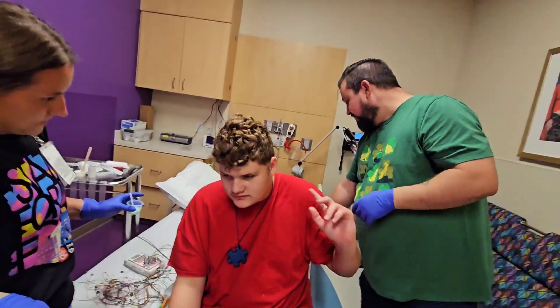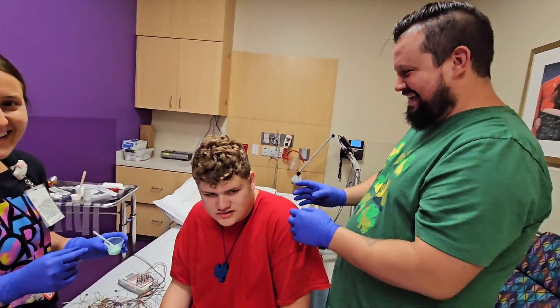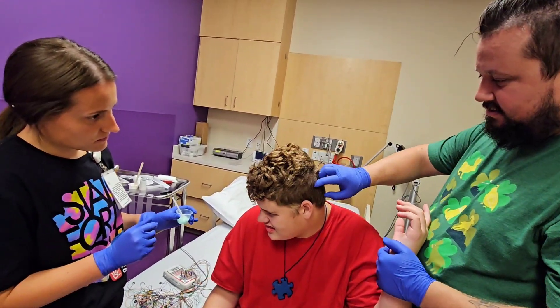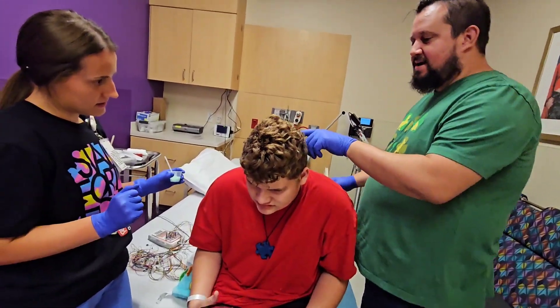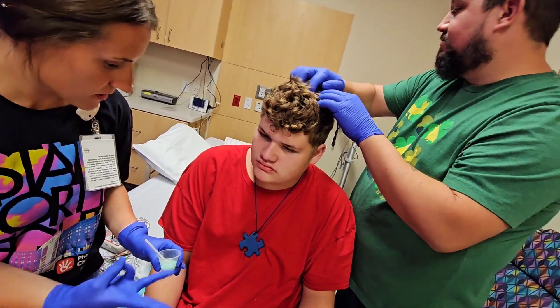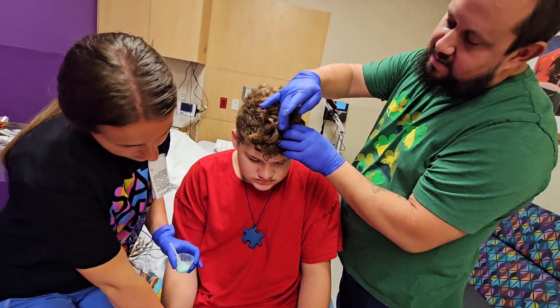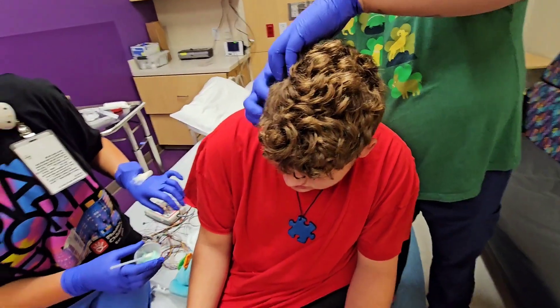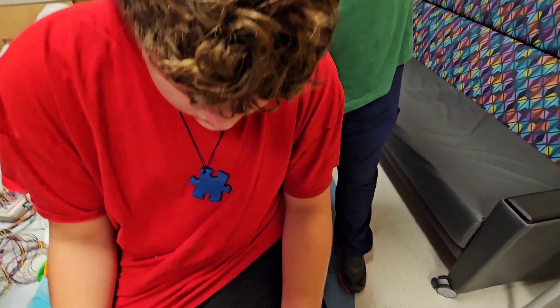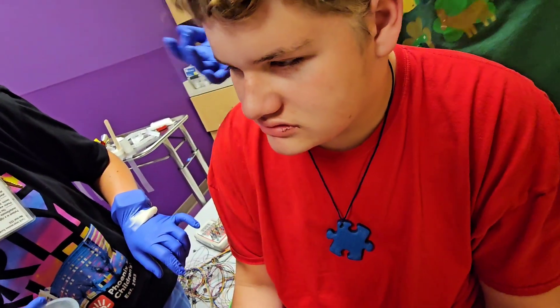One, two, three — there's one buddy, good job! You're gonna count with us, okay? 23 more, we're almost done. It's okay, we're gonna count to three again. You ready? One, two — it tickles a little bit, that's all. One, two, three — yay! JJ, good job buddy! We're doing it again right here — one, two, three. You're doing so good JJ, I'm proud of you. One, two, three — good job! Ready, one, two, three. Where's our musician, where's our guitar? Let's go JJ, let's do this! Let's find it — one, two, three. Good job, there you go.